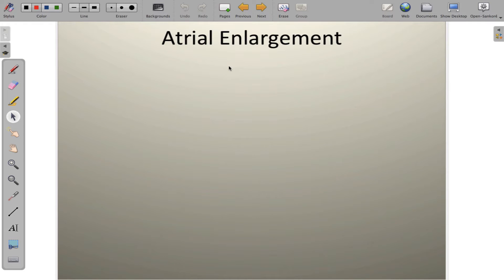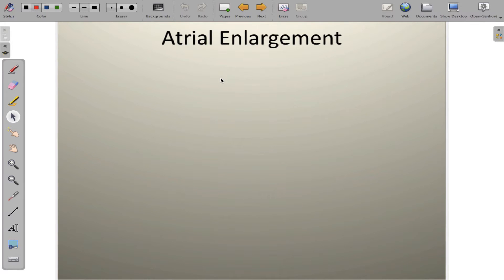Greetings everyone. In this video, we're going to explore how to determine if there is chamber enlargement on the 12-lead EKG. We're going to look at atrial enlargement and ventricular enlargement, and all the rules needed to interpret those things. So let's take a look at atrial enlargement.